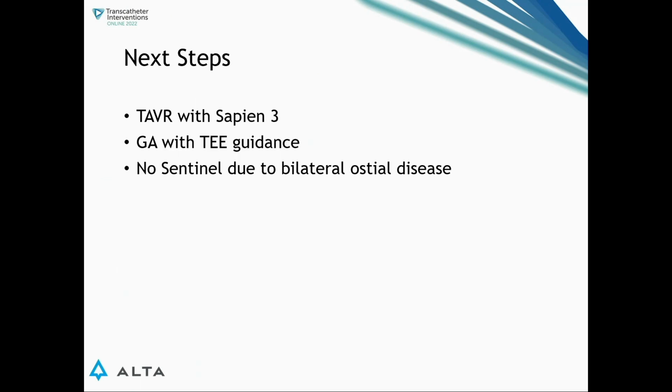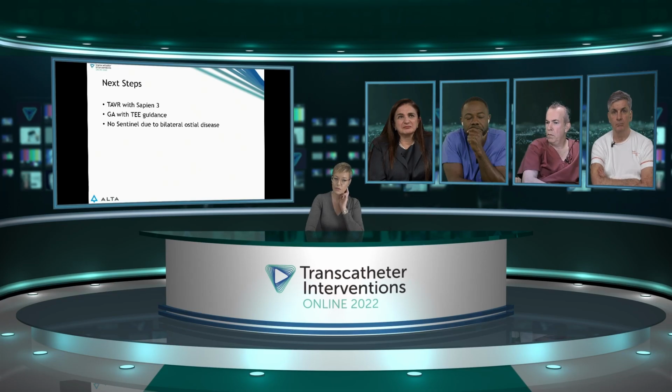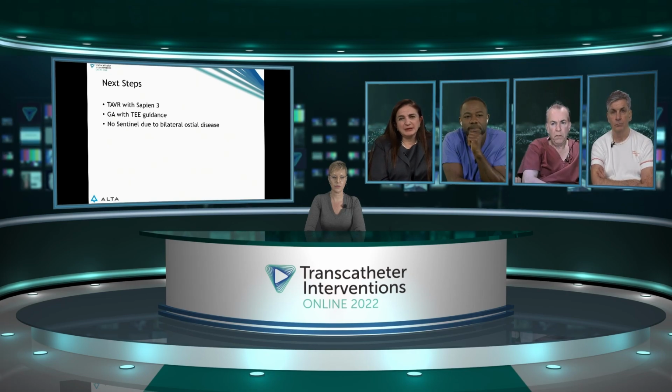Next slide. So now at this point, we had planned this as staged, this was about 2 weeks ago. Patient is proceeding with TAVR with SAPIEN 3. I know there are different ways to do this. In complex bicuspid borderline sizing, especially with the balloon expandable and a calcified raphe, unless the patient is high risk for intubation and anesthesia, we've done TEE guidance for these types of cases.